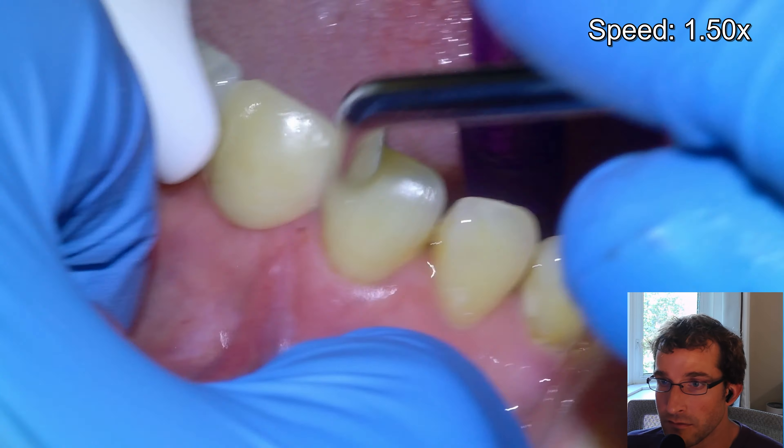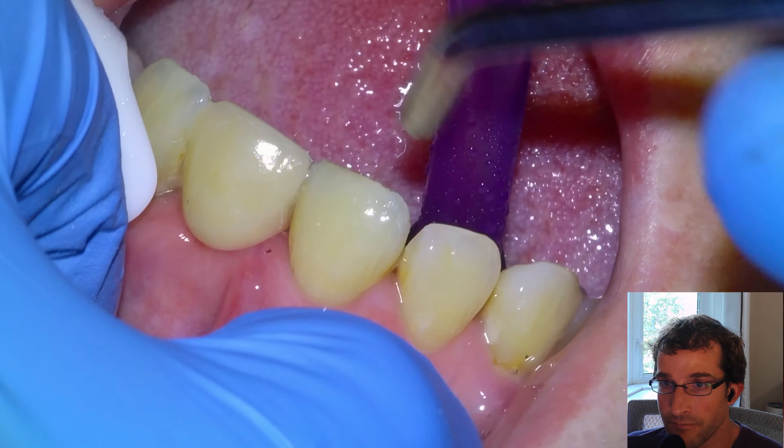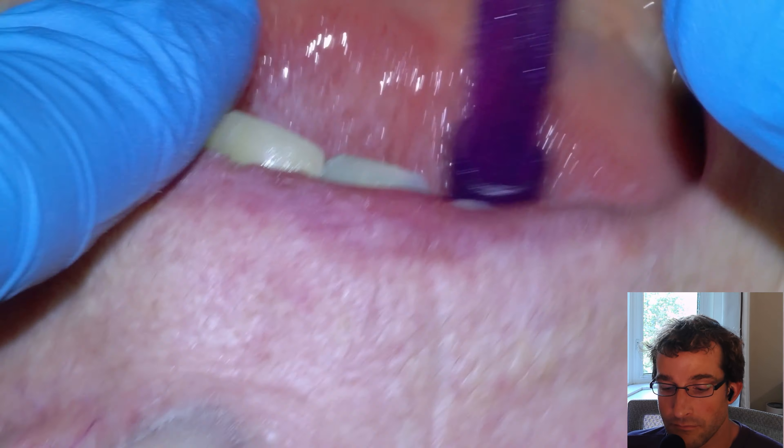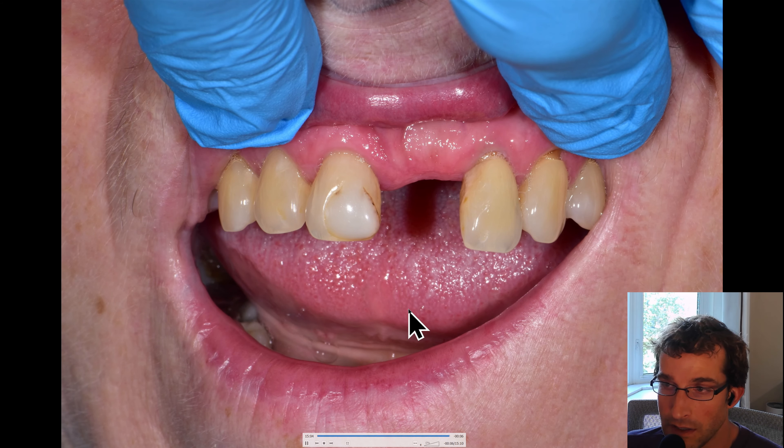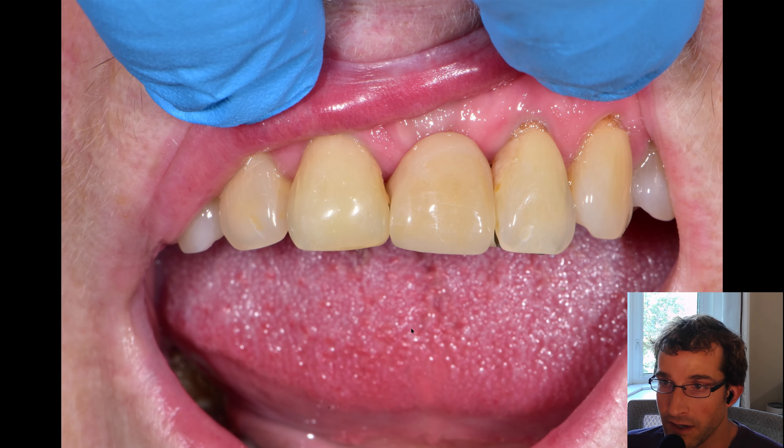Just going to skip to the end with the final result here — and there's the before and after.